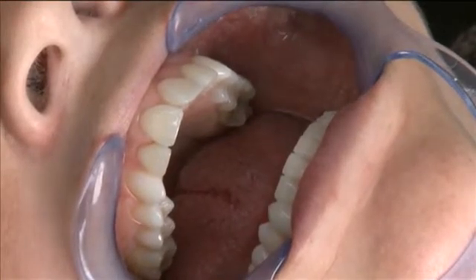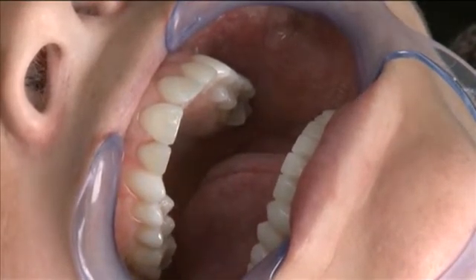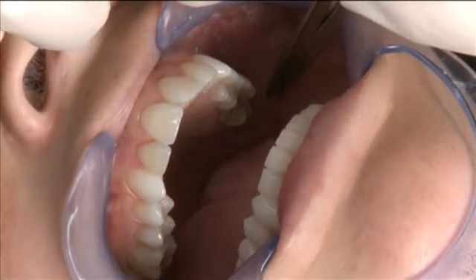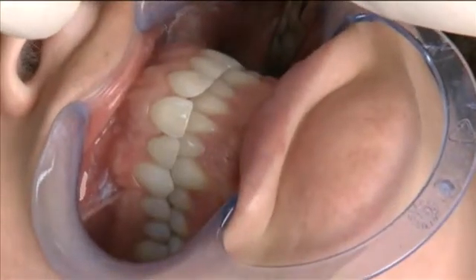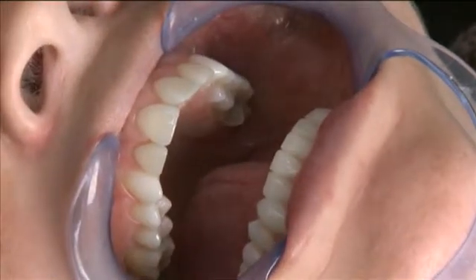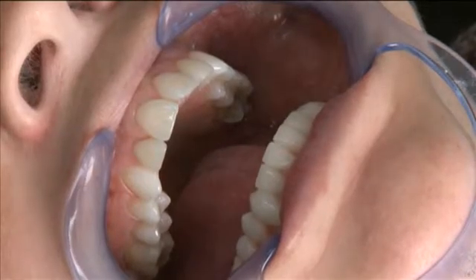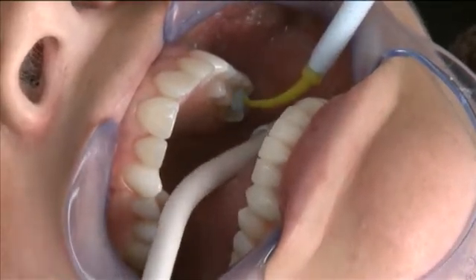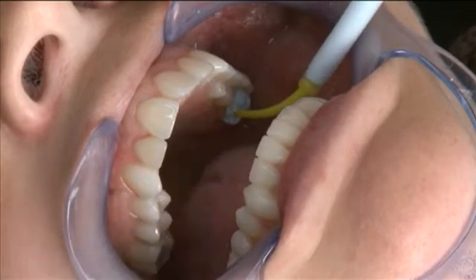Now that I've completed the prep for this onlay, I'm going to capture a bite registration. In order to do so accurately, I'm going to verify that she has a holding contact distal to the tooth I prepped — and indeed she does. I'm going to now inject the bite registration directly into the prep, filling just above the level of the occlusal plane but covering the prep only.